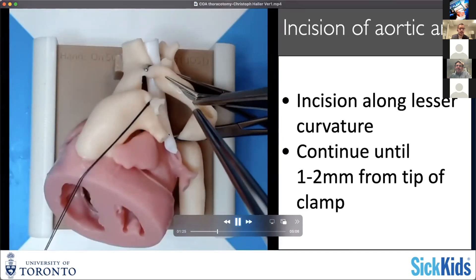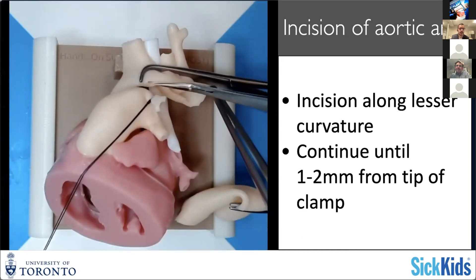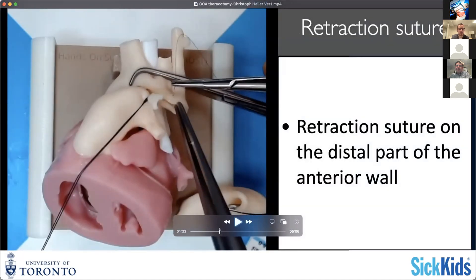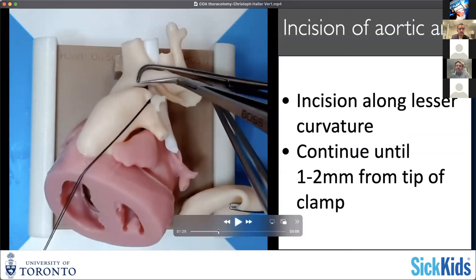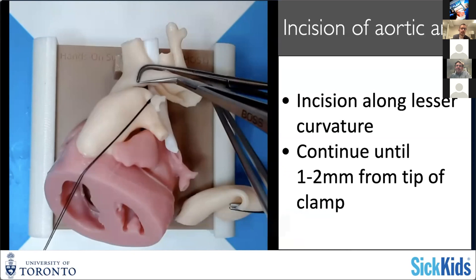Then I incise longitudinally into the underside of the aortic arch. Depending on the degree of hypoplasia of your arch, that incision may go right up to the clamp. You can even cut right up to the clamp and pass part of the sutures in between the tip of your clamp to maximize the area that you're augmenting. This is the region where it becomes clear why we measure the size of the tubular hypoplasia at that segment — because this is as far as your augmentation can go. If that segment is inadequate in size, it won't be addressed sufficiently with your extended end-to-end repair.